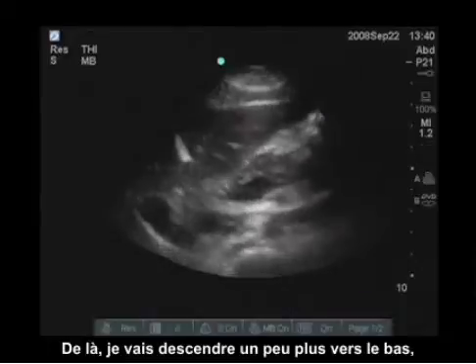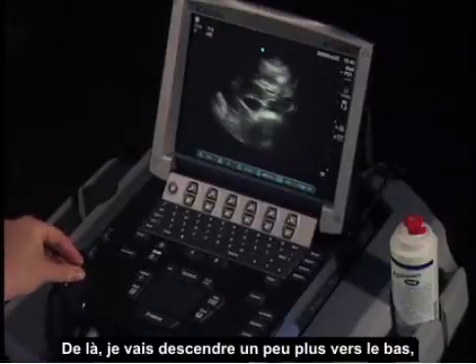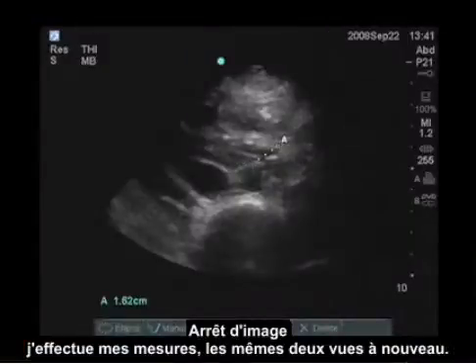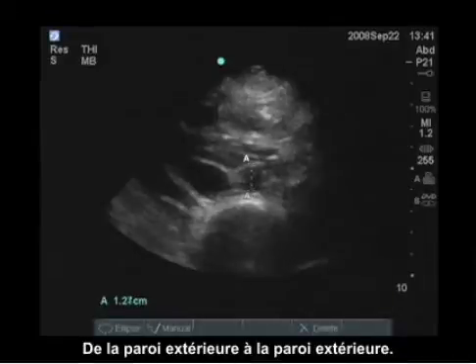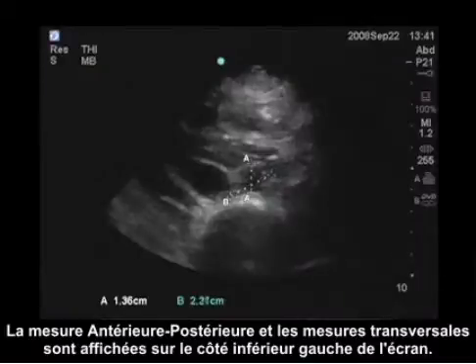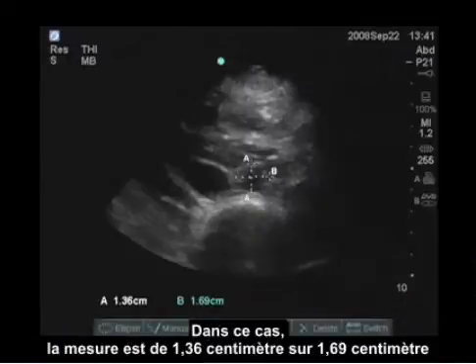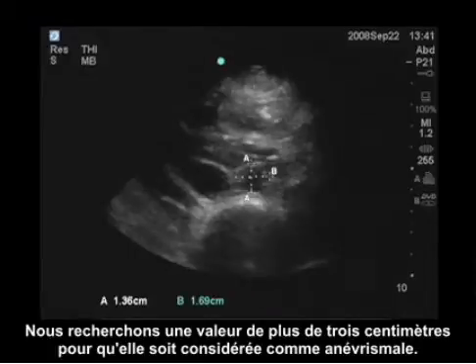From there, I'm going to move down a little bit more inferior. Optimizing the image so I can see the wall of the aorta clearly. I will freeze the image and perform my measurements — the same two views again, from outside wall to outside wall. That's the AP measurement and the same with the transverse. The measurement is displayed on the bottom left of the screen. In this case, our measurement is 1.36 centimeters by 1.69 centimeters. We're looking for a value of over three centimeters to be considered aneurysmal.